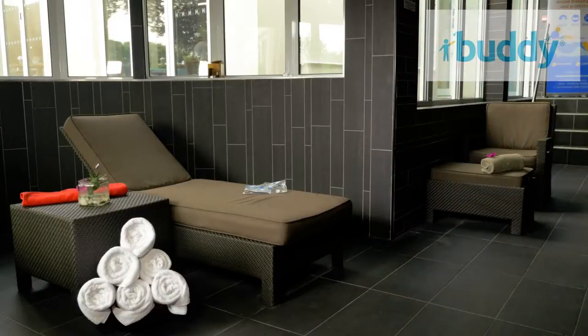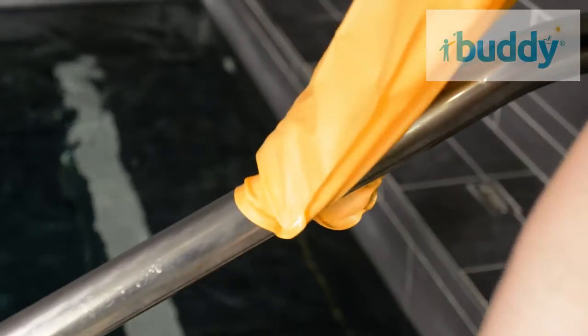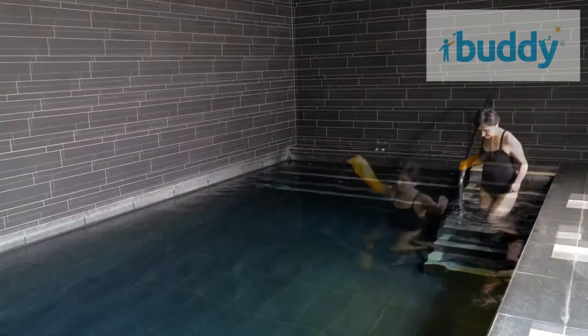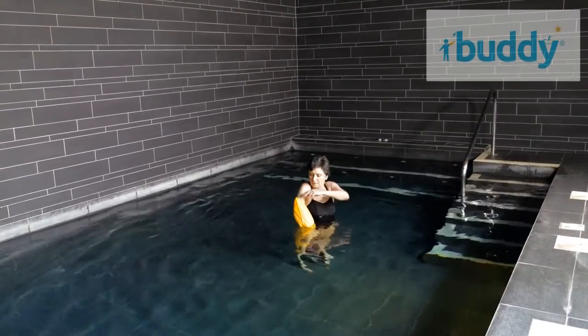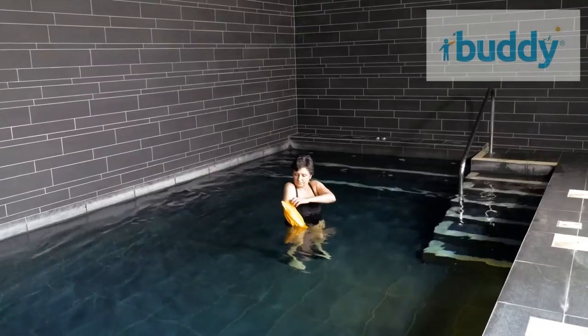Buddy covers are designed to give maximum mobility and use of your limb, even in the pool. Simply place your limb into the water. As you do so, the air will rise.